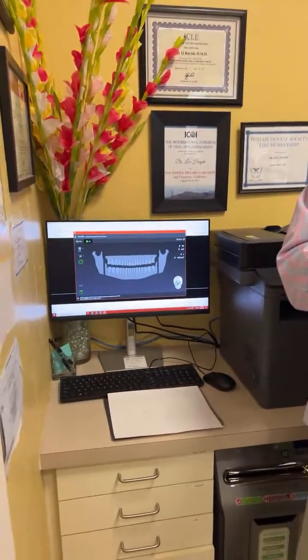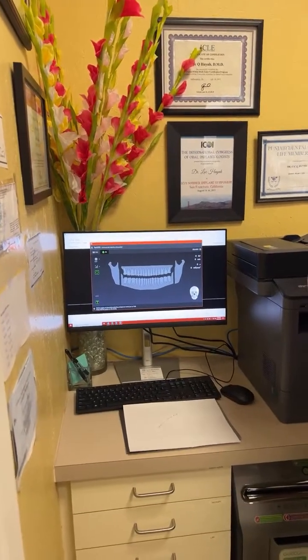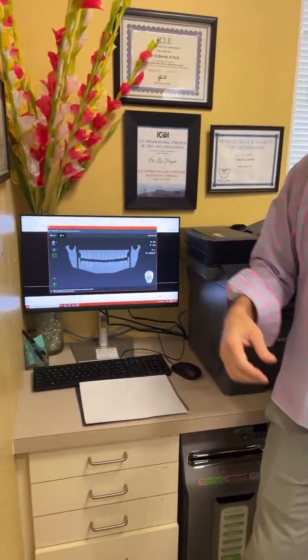So when you're doing a consult on tooth number 4, let's say you're doing an implant, you can click on that, and any images you have associated and tagged by that number come up, up to 12 at one time. So imagine consulting with a patient and you want to look at what the radiograph looks like, what the CT looks like, what the STL looks like. We have a camera photo of that too. Well, it's all there. You don't have to hunt and peck and look around in your database trying to find all the data that you want to do a consult with a patient. It's there.